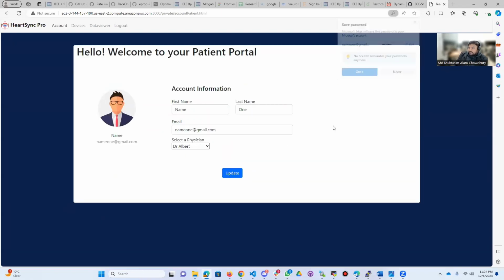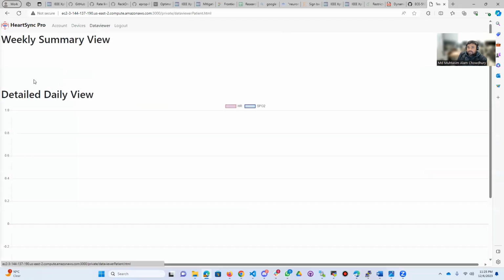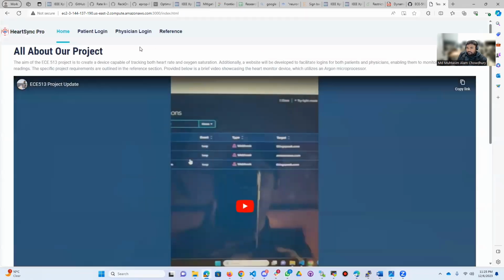Here you can see the patient can choose any physician out of three. It shows the name, last name, and the email. Also make sure that the first name and last name are strings, not numbers. And the device name and device serial, the data viewer with summary, weekly or daily views, and the logout.